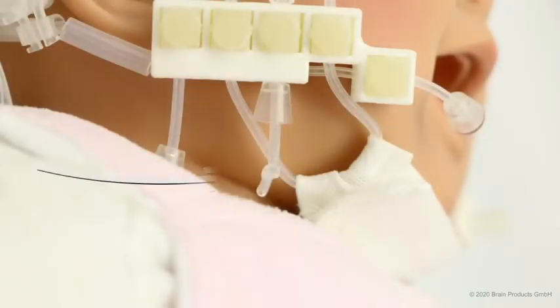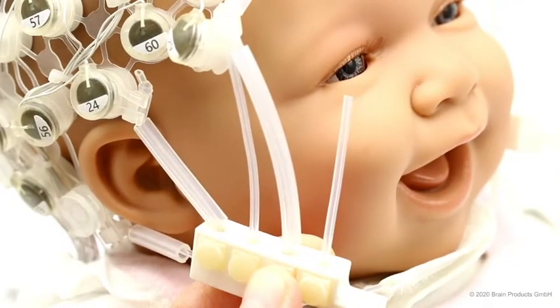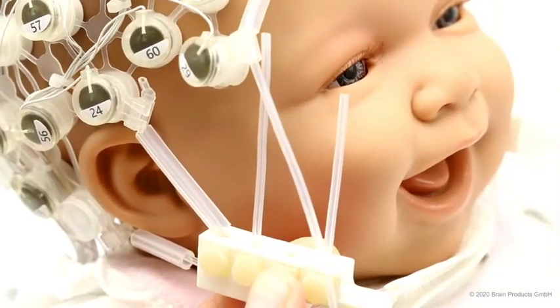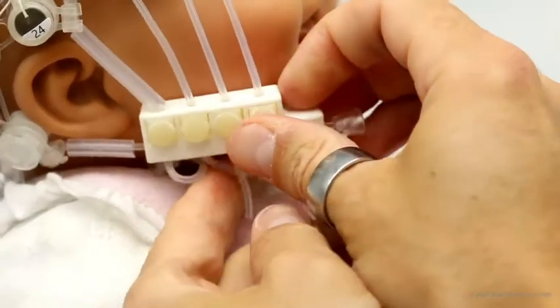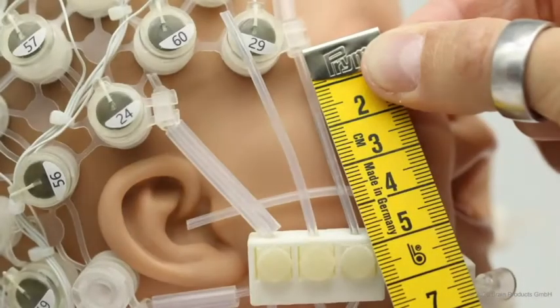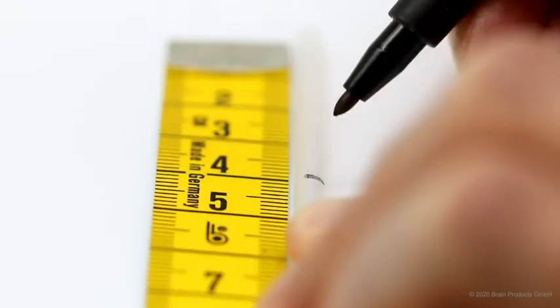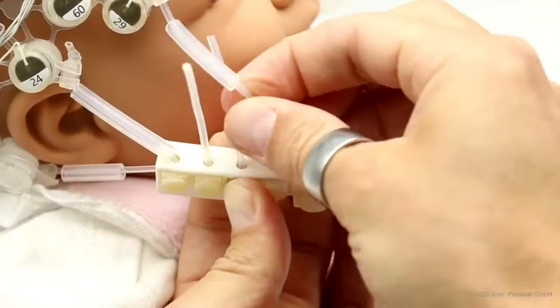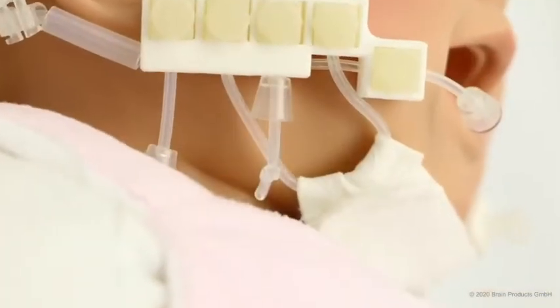First, untie the knot. Next, press and hold the button on the clamping block that corresponds to the tube you want to replace. Pull out the silicone cord and remove the tube. Reinsert the cord and adjust the fit. Measure the length for the replacement tube. Mark and cut the tube. Slide the replacement tube over the cord. Insert the cord into the clamping block. Put the cover on the cord and tie the knot.